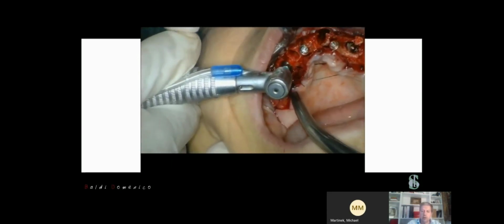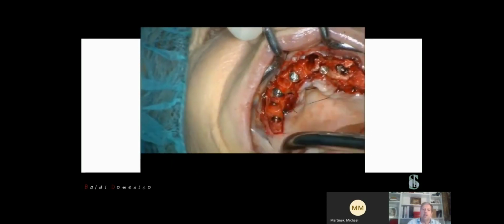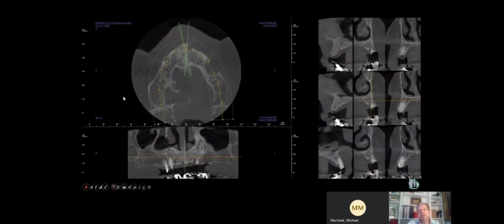Transform a very difficult situation into a very simple one. We can place our implant, sure about our work. If we analyze the X-ray, we can understand why we decide to work in this way. You can see that this is a very difficult situation because we have to make the extraction. We have a very bad quality of bone, and in some places we have damage.